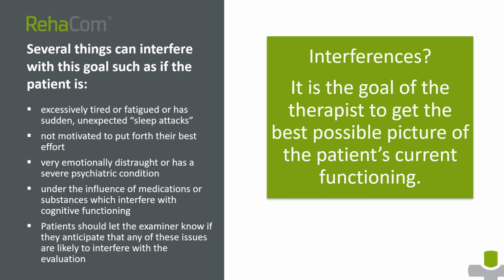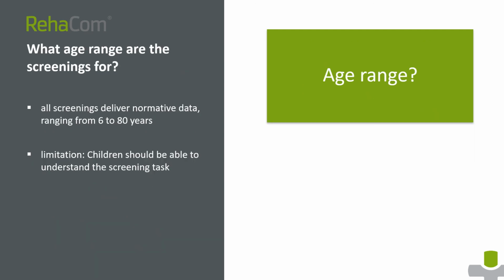Patients should let the examiner know if they anticipate that any of these issues are likely to interfere with the evaluation. What age range are the screenings for? All screenings deliver normative data ranging from 6 to 80 years.